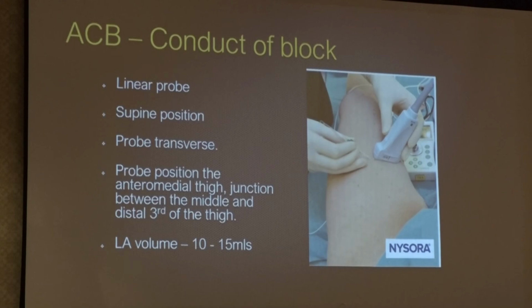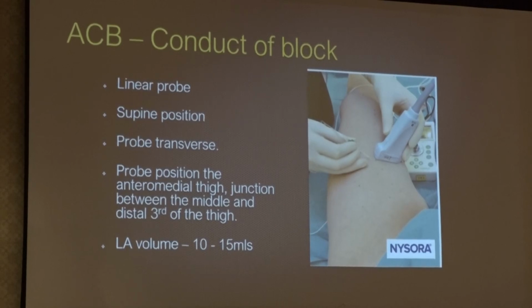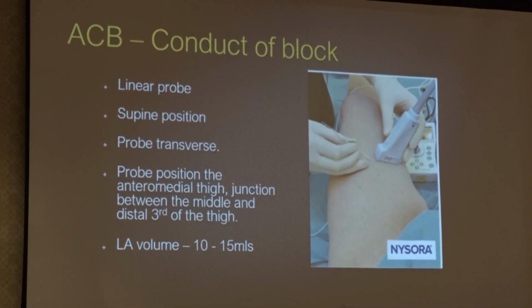All right? So like all regional analgesia techniques, the process of scanning is very important. It's not just a point where you look at it and that's where you inject. You must be able to recognize the structure, even though this is a simple block. And the point of injection comes from the scanning process, where you identify the structure and find the best point.